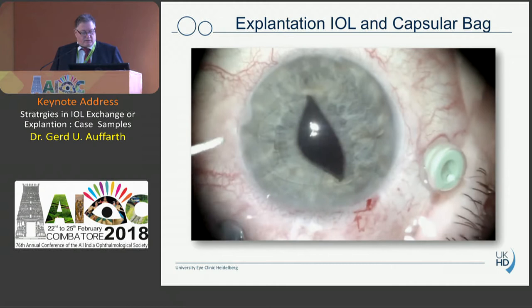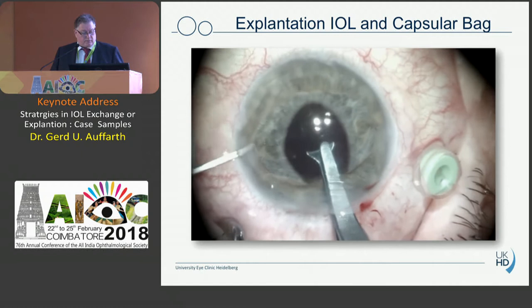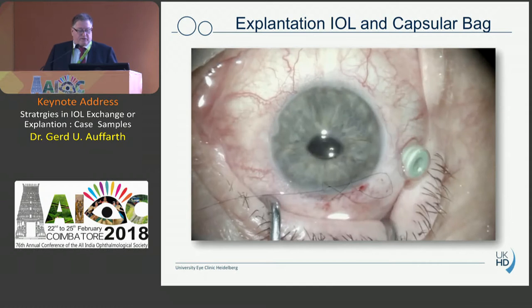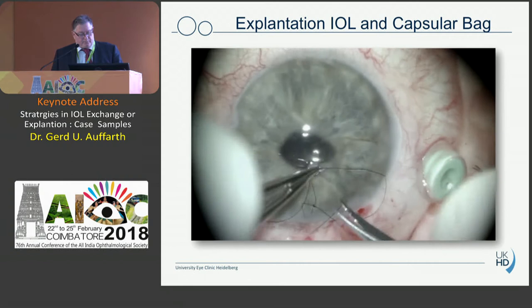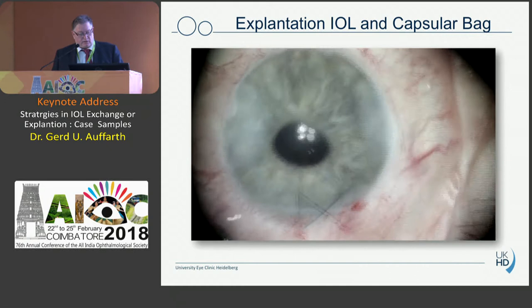You put it under the iris, lift it up, and you can easily see how to enclavate it from this part. Do the same on the other side — take it in, take it down, lift it up, and just put it in with a small spatula. Very easy. In Germany we have had experience for more than 15 years with retropupillary fixation. It really is a very elegant method. I close the wound and take off the trocar, and the whole thing is done in a fairly small amount of time.